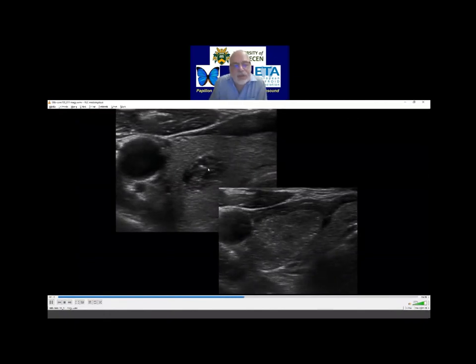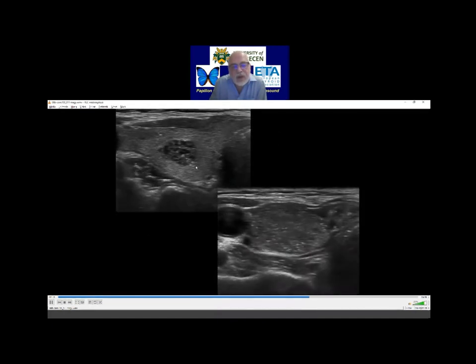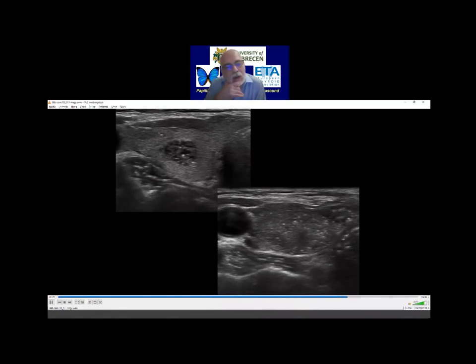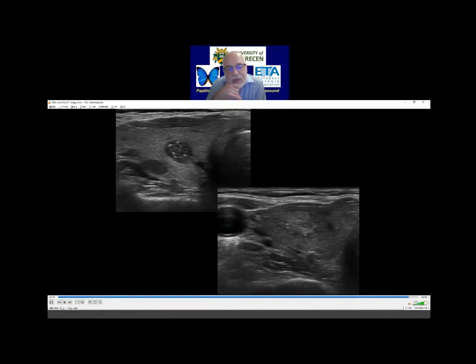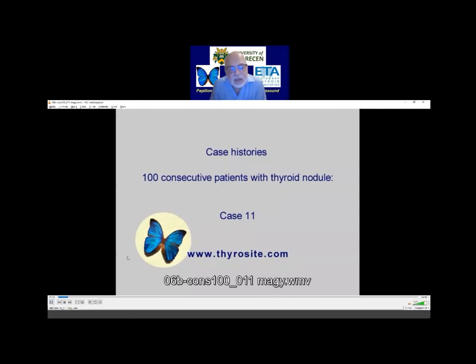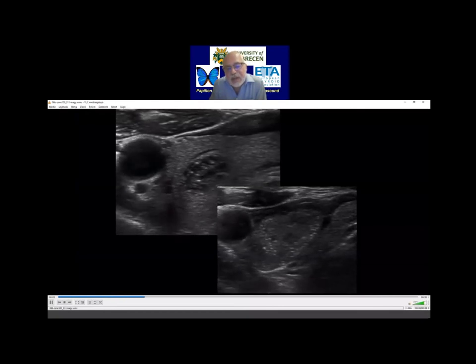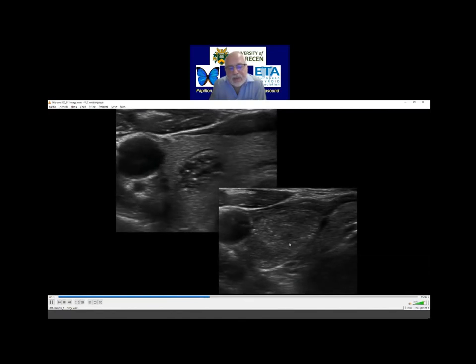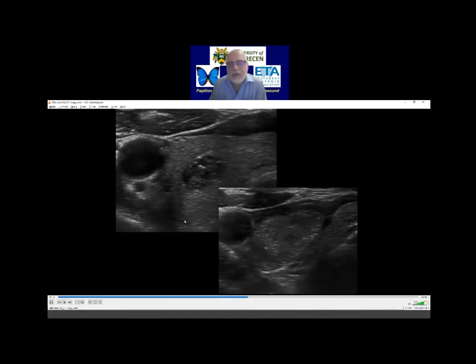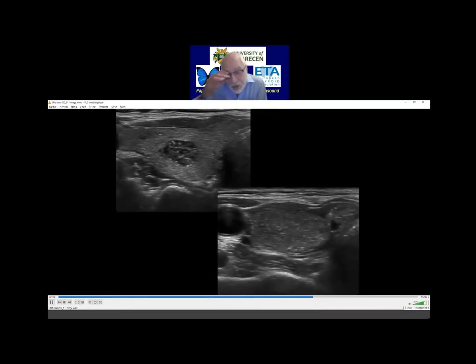I cannot fully exclude the possibility that this nodule has microcalcifications, but I don't think that we should unequivocally state on a medical report that this module has microcalcifications. We can raise the possibility, but when we compare these two — this has, this might have microcalcifications. Questions, comments?